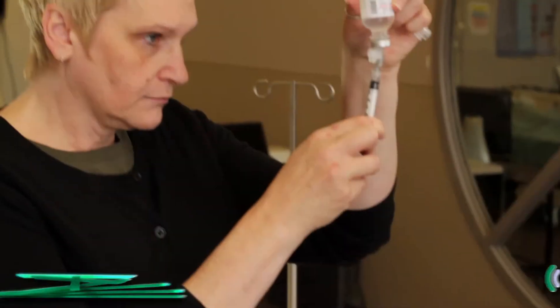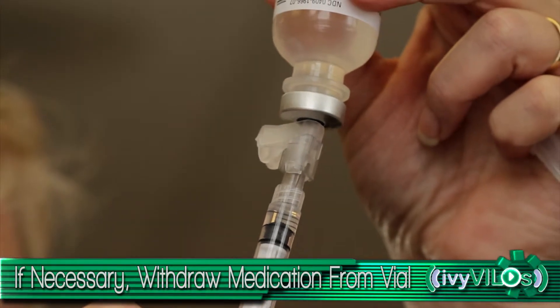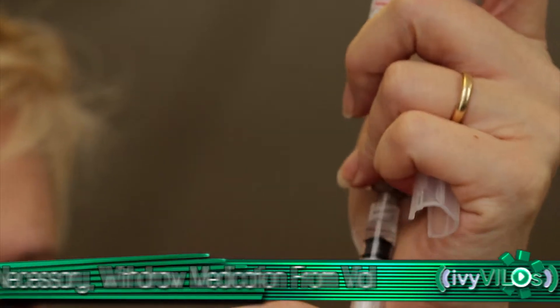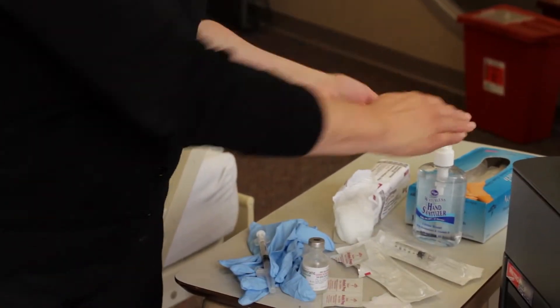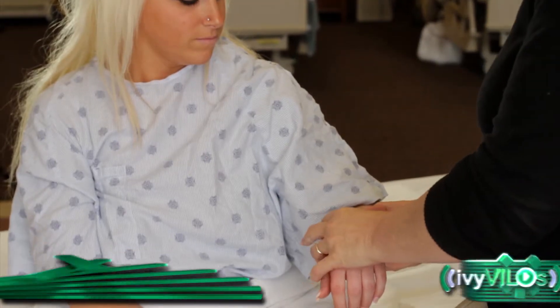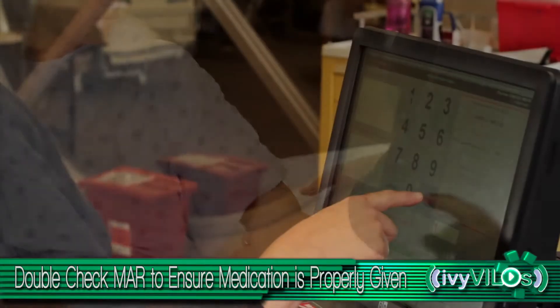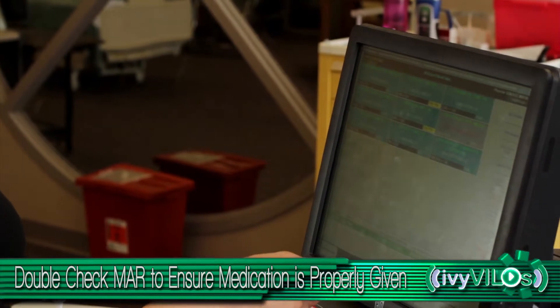If necessary, withdraw medication from ampoule or vial. Perform hand hygiene. Verify the MAR once more to be sure the patient is receiving medication at the correct time.